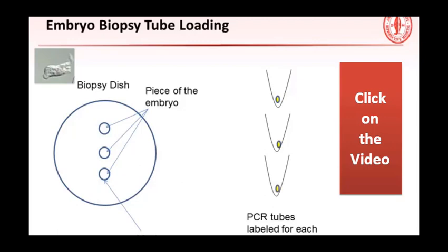underneath the dissecting microscope. Visualization of the embryo biopsy material can be difficult at times. However, it becomes easier with practice. Dry loading makes visualizing the embryo piece more difficult. However, it minimizes media volume and helps assure a proper read during the testing procedure.